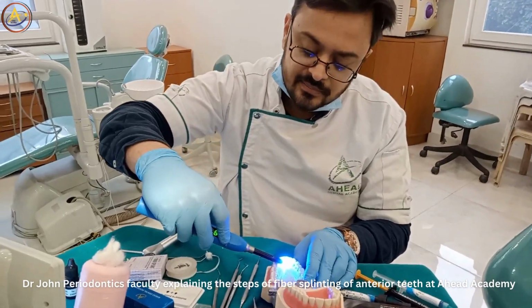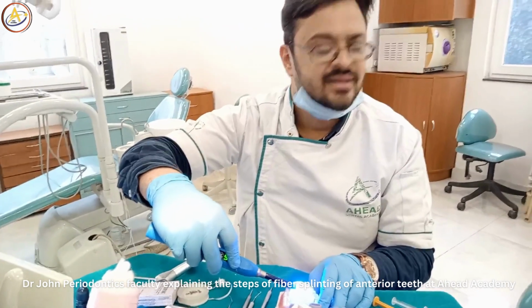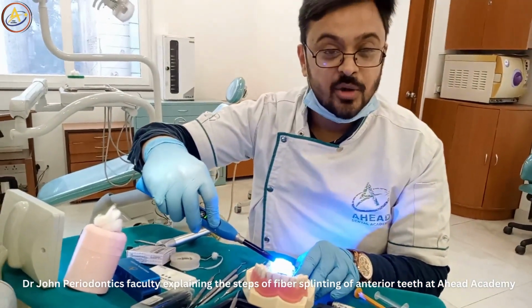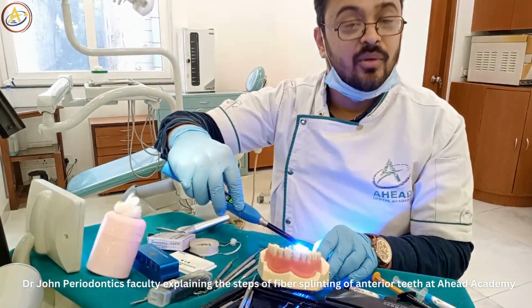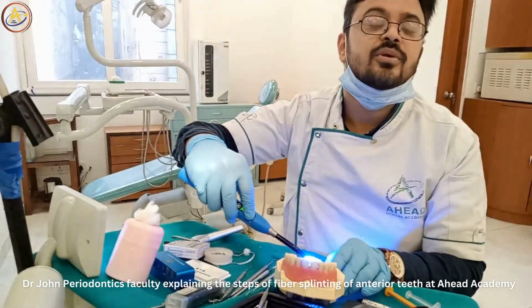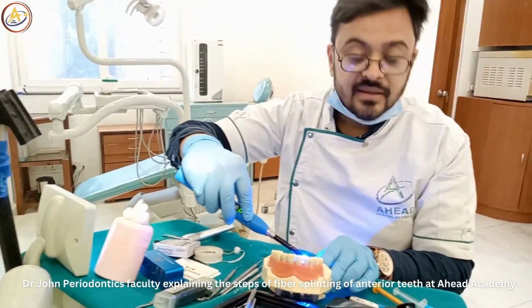Okay. Always remember the basic steps. Etching you have to do for 20 seconds, then you have to do the composite. Okay. Etching should remain for 20 seconds, and then you have to clean with water. Okay. Then bonding, always remember, never do it randomly. Do bonding, 20 seconds curing each and every tooth. Okay. And then the main part, the composite.